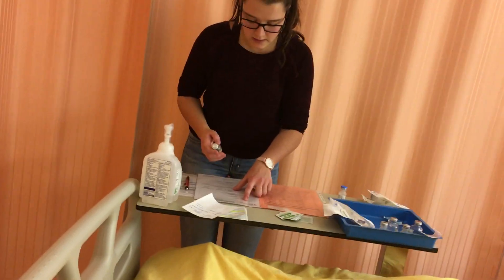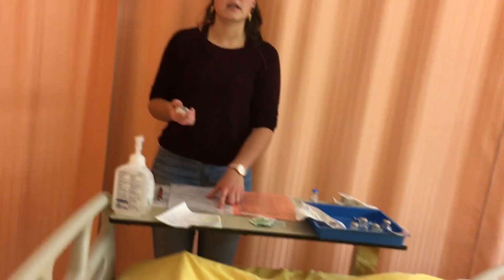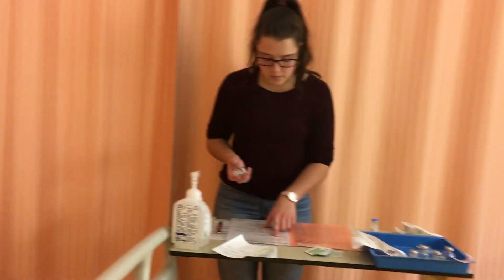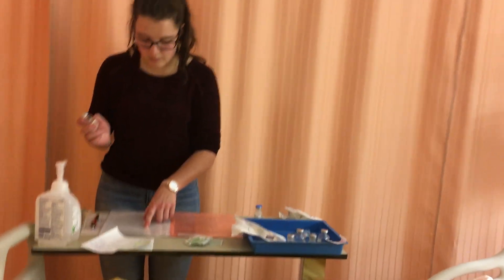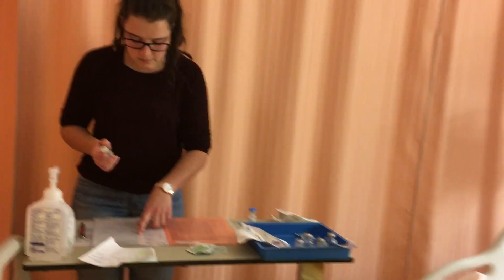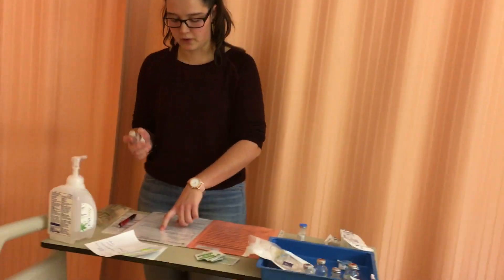Cloxicillin is an antibiotic, which is appropriate since my patient has a respiratory infection. It can be given by a student nurse. The maximum single dosage is 3 grams and we are in the appropriate range. It comes in 2-gram vials that need to be diluted with 6.8 milliliters of sterile water for injection.